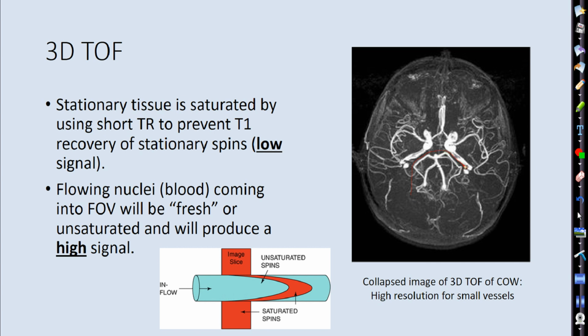Has anybody done this yet? Yeah, I've seen them do it. I did one yesterday. And then what they do is you can either erase outside the area that you created or keep the area inside that you created. Then you rotate it and try to get rid of all the extra stationary tissue so you can really see that posterior circle of Willis in very good detail.